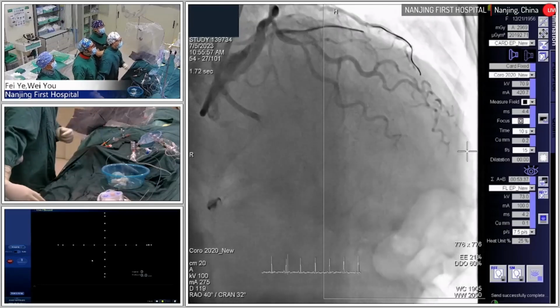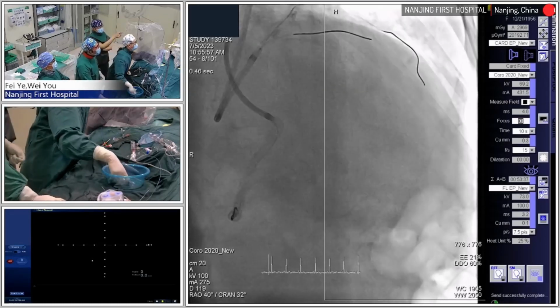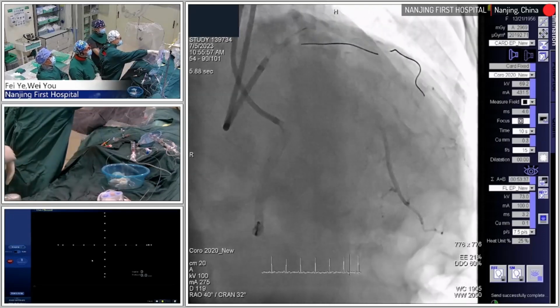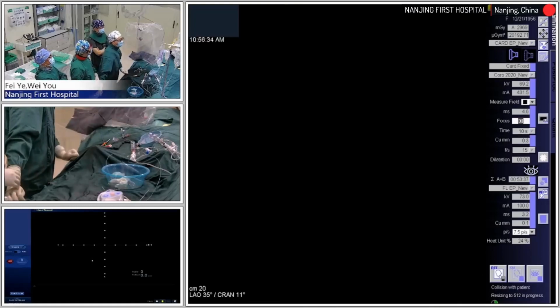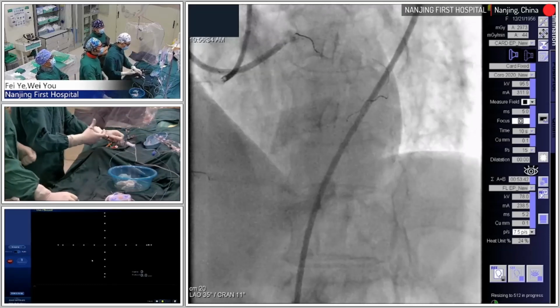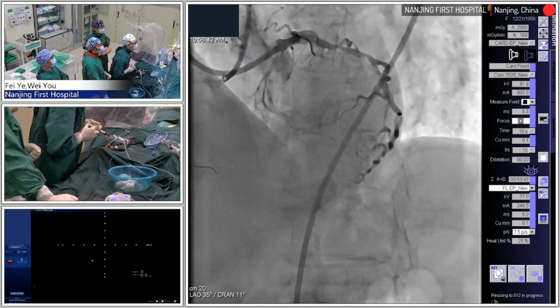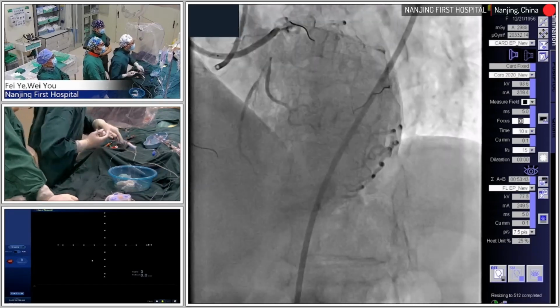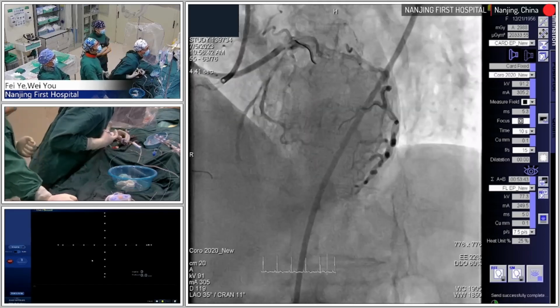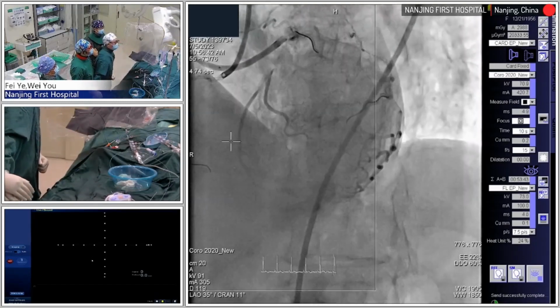Use this angulation, you can find the proximal branch. Maybe there's a distal one, yeah, distal one I think. Before that, I will make sure the epicardial is okay. Seems no damage, no contrast staining or perforation. I think it's okay. Try the surfing technique from the distal PDA.